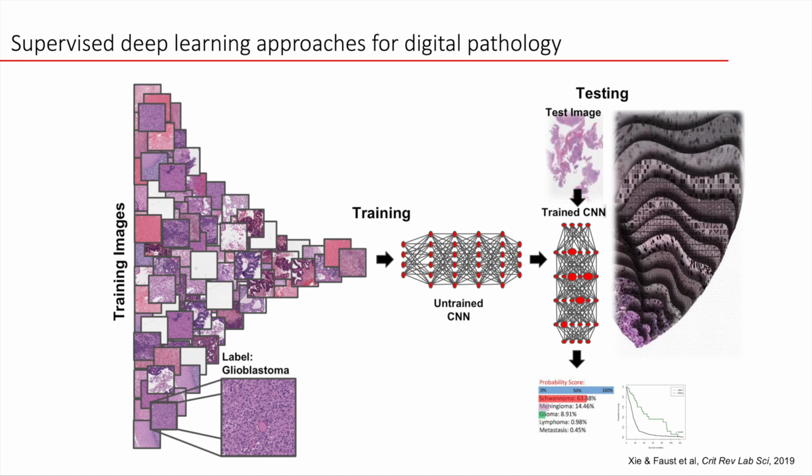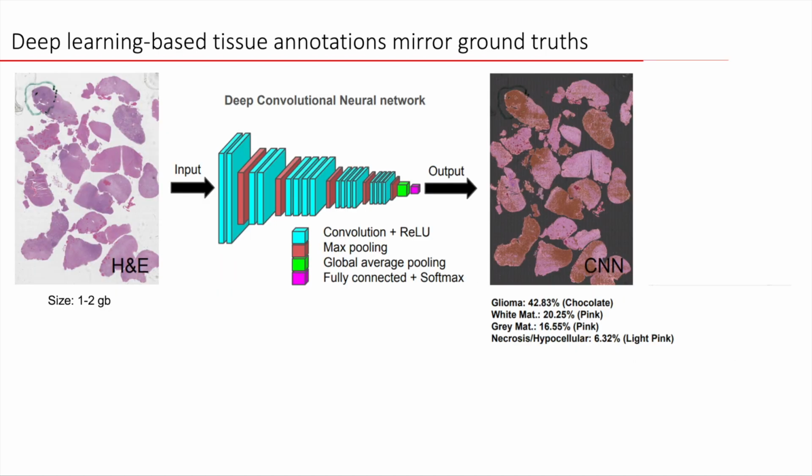This process is laborious, but once they're trained, they work very, very well at analyzing future images pixel by pixel, finding those specific feature representations, passing them on to deeper and deeper layers where the feature representations become more complex. And then finally, in the final layer, the most complex and informative feature representations are used to make classification decisions. And this works extremely well.